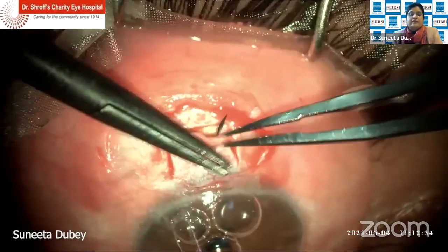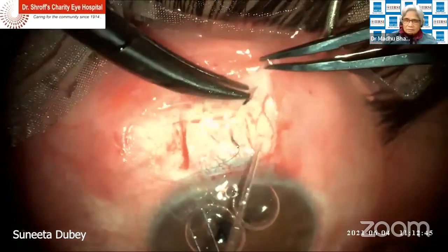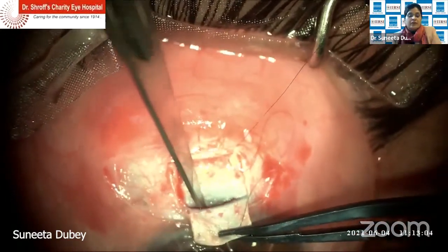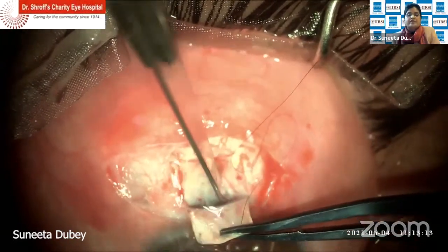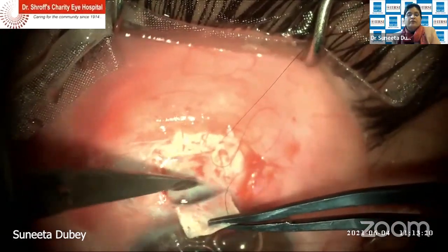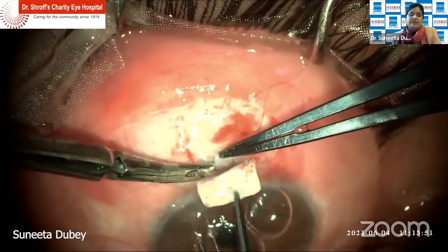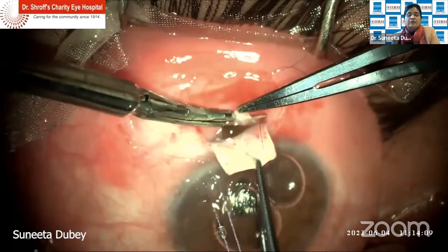And the side port, you should have talked about that. It is said that the base should be wider at the limbus so as to have more resistance, and the aqueous will not flow sideways. So this is an 11 number knife? 5 by 4 rather than having a square one, so that you have more width on the sides. Yes, you find some resistance to flow on the sides and it will flow posteriorly.